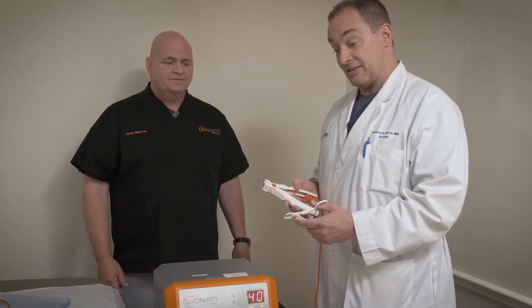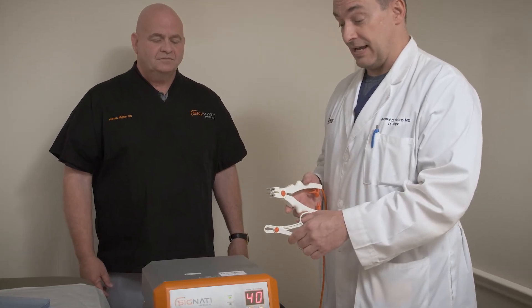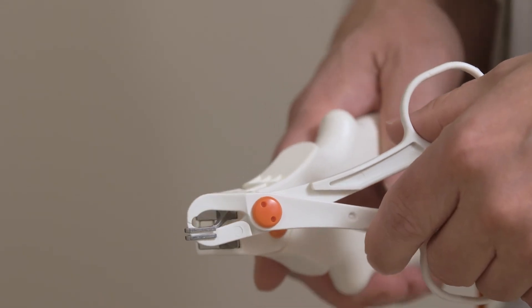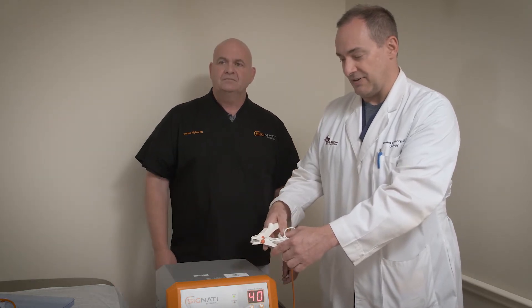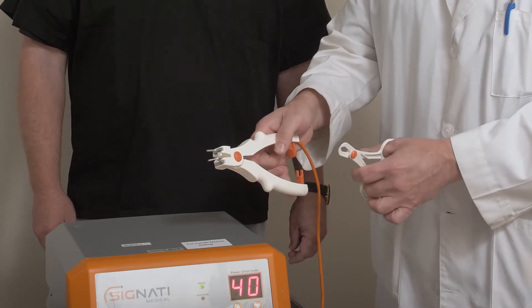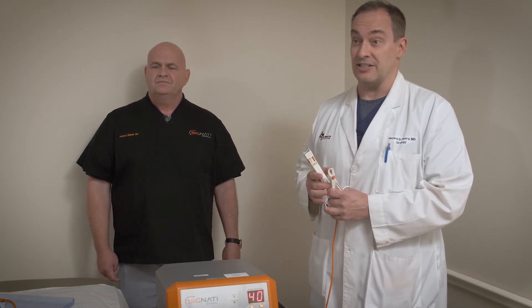So we have the vas clamp, we'll isolate the vas, clamp it on. We will then take the handpiece, slide it around, clamp down, and then we'll give the energy. After five seconds we'll stop, pull out our specimen, undo the clamp piece, and we're done. Hopefully it'll take a total of 20 seconds roughly per side, with five seconds of sealing.